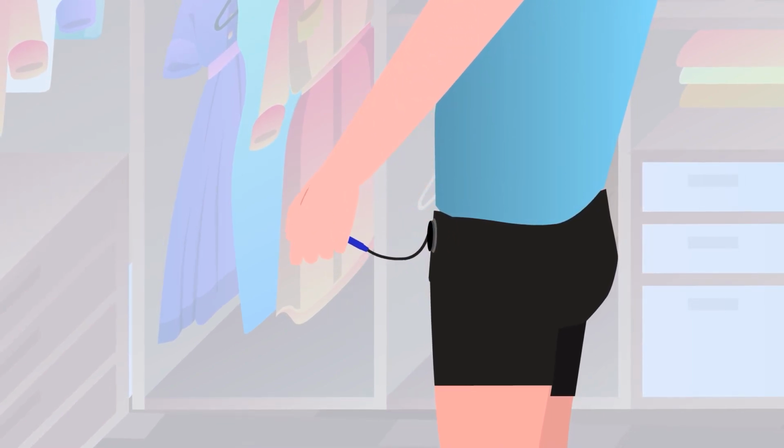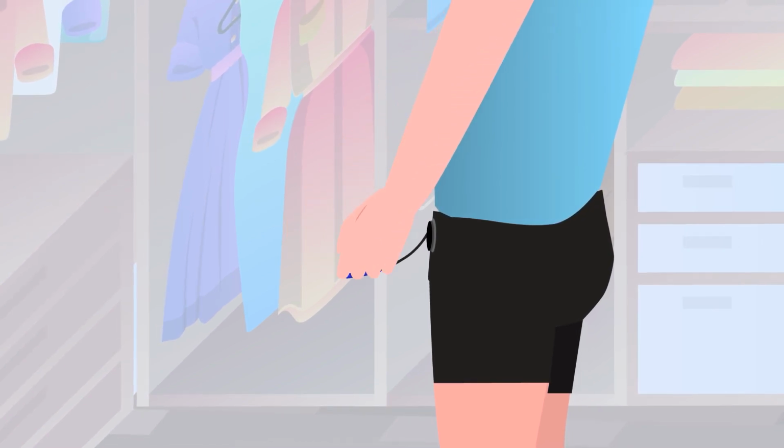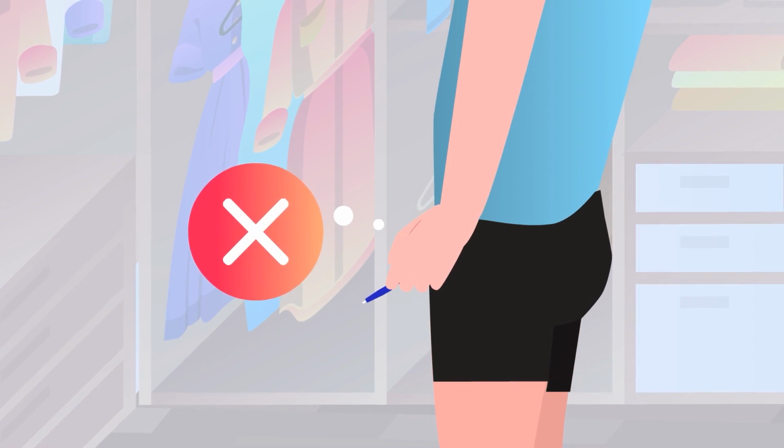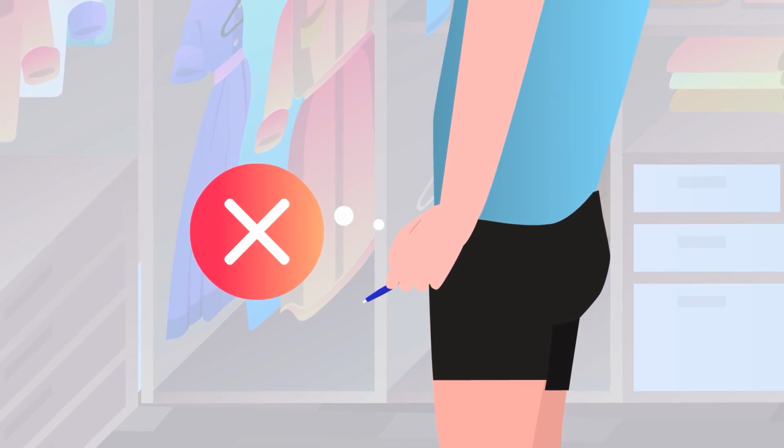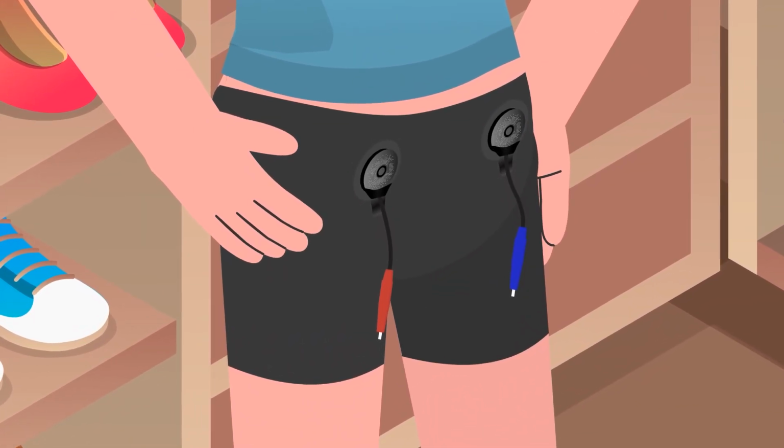When putting the shorts on, be sure not to pull directly on the cables or roll the waistband out. It is also recommended that the shorts aren't pulled from the bottom of the connectors. Ensure the whole surface of each electrode is in full contact with your skin.